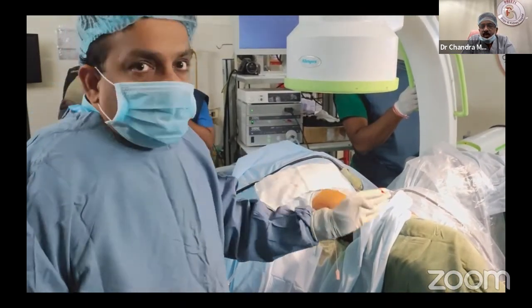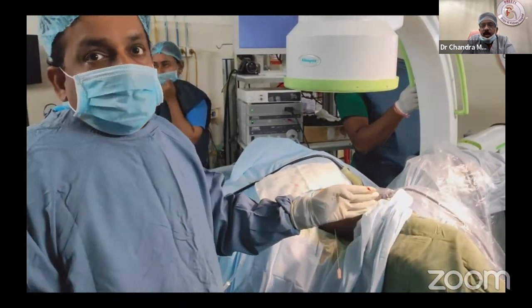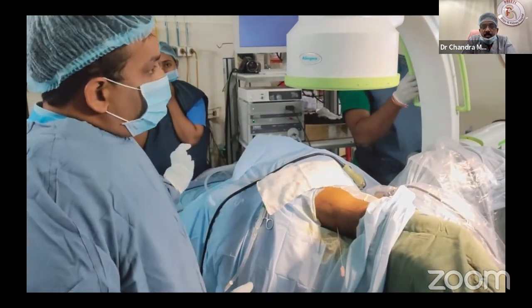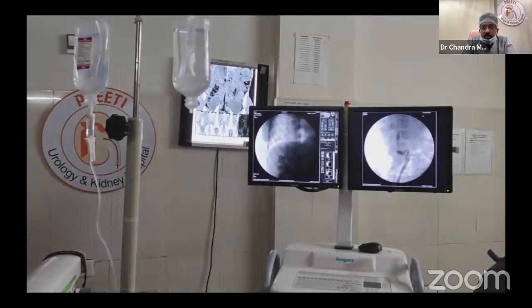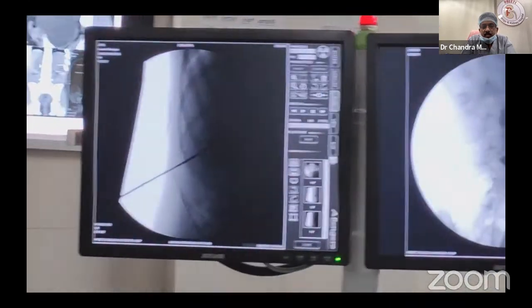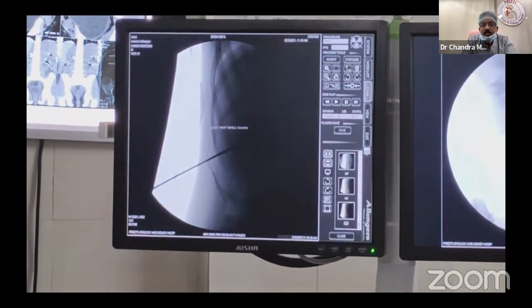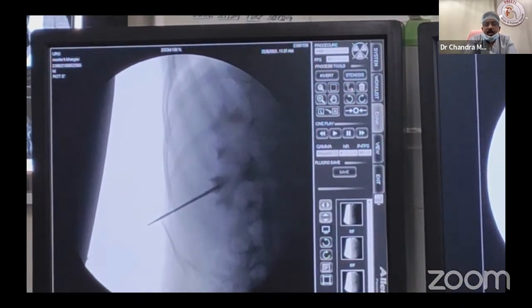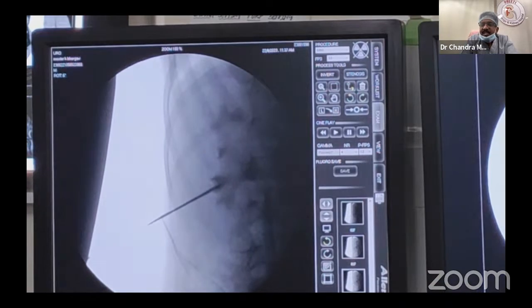If the needle goes down, it is anterior. If the needle goes up, it is posterior. Now shift. Now see, that type of variation comes in supine PCNL. You can tilt the entire C-arm up. Why it is dark? It is coming. So it is like this. Now when the C-arm is tilted towards the head end 30 degrees, it is still falling. If you carefully see, it is a few millimeters not in the cup.